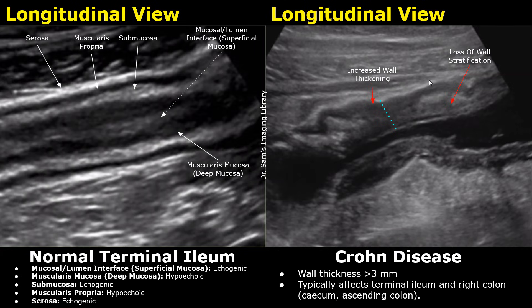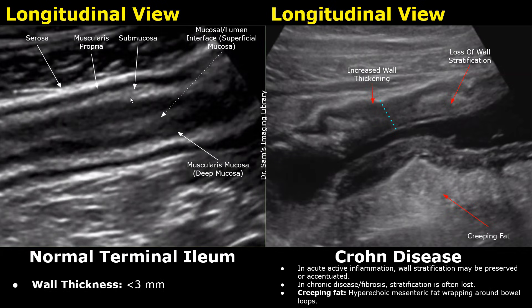The image on the right shows an ileum affected by Crohn's disease. In Crohn's disease, the bowel wall thickness will be greater than 3 mm. Usually the terminal ileum, the cecum, and ascending colon are affected. Wall stratification refers to the layered appearance of the bowel wall. Loss of wall stratification means we will not see the distinct layers. In acute cases, wall stratification may be preserved, but in chronic inflammation, as in this image, we see increased wall thickness and loss of wall stratification.